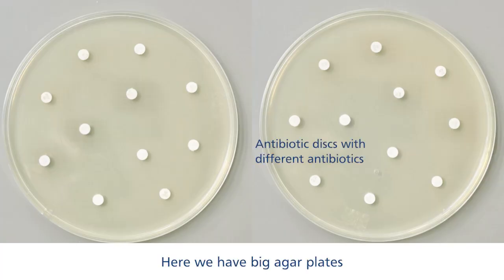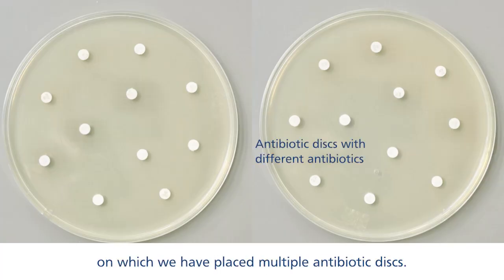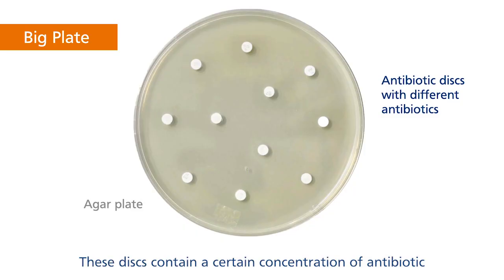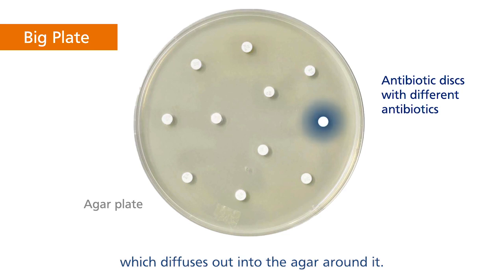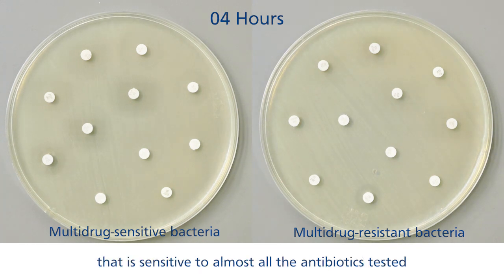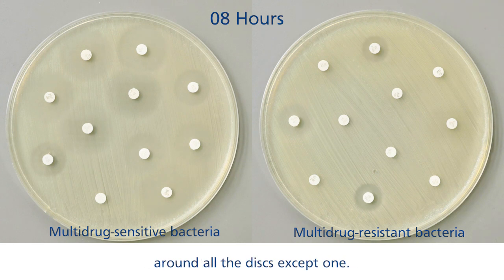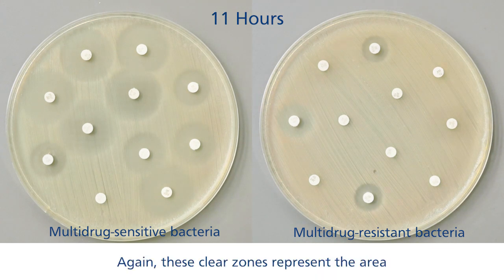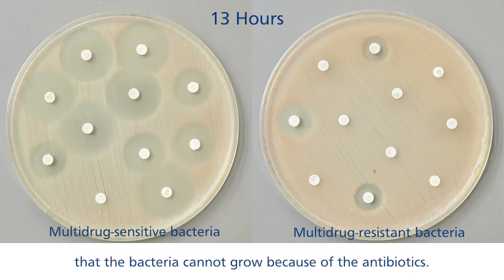Here, we have big agar plates on which we have placed multiple antibiotic discs. These discs contain a certain concentration of antibiotic which diffuses out into the agar around it. On the left, we have a typical bacteria that is sensitive to almost all the antibiotics tested, and you can see clear zones of inhibition around all the discs. These clear zones represent the area that the bacteria cannot grow because of the antibiotics.